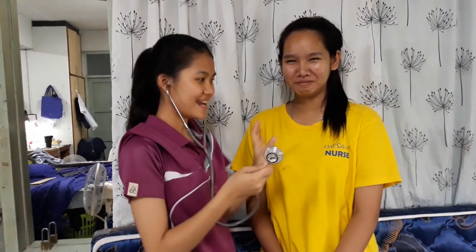Structure of stethoscopes. First, the earpiece, made from plastic. Next, the binaural, made from metal. Double lumen tubing made from PVC, and the chest piece made from stainless steel. Put the earpiece on the ear and place the chest piece on the area you want to listen to.